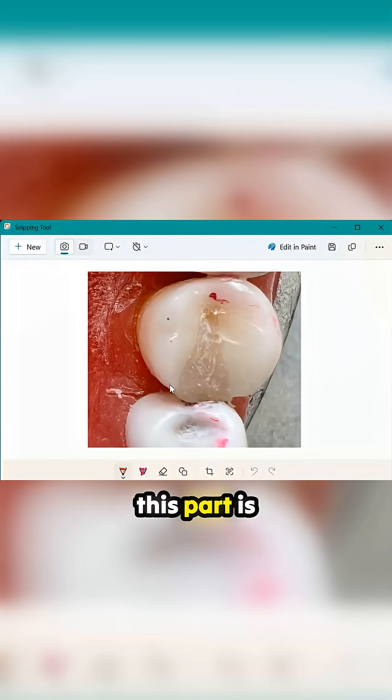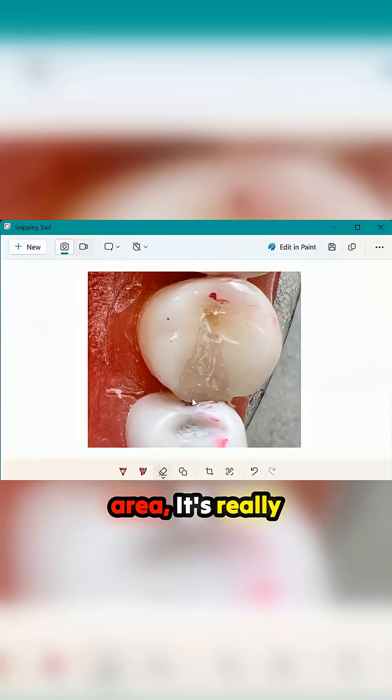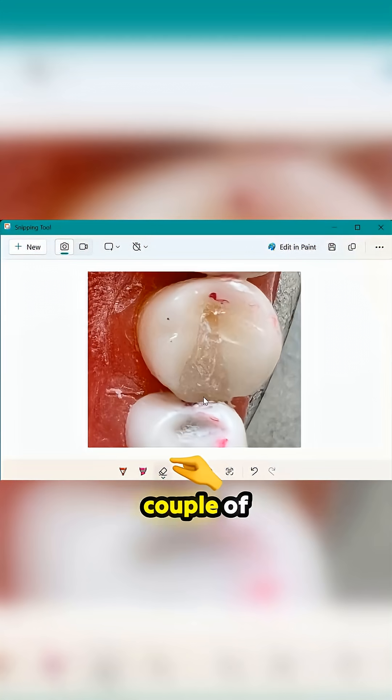First of all, this part is bulging out. This needs to be smooth — it needs to follow the curvature of this tooth. And your contact area is way too broad. If I look at this contact area, it's really big; it's touching this tooth by a couple of millimeters.